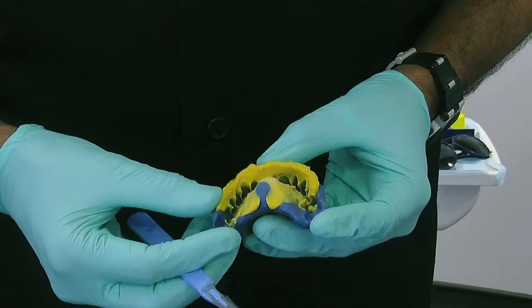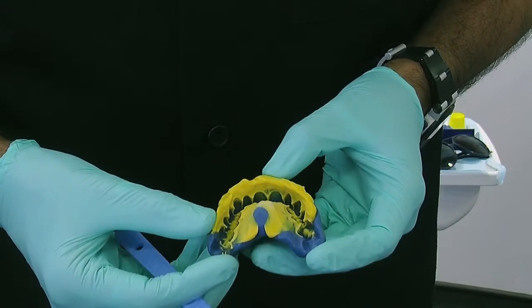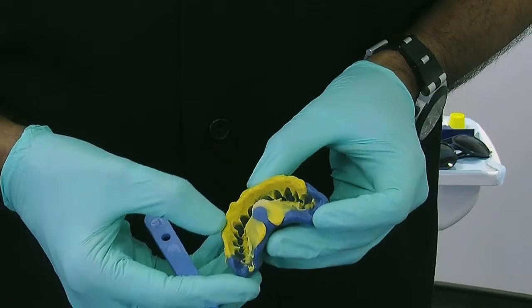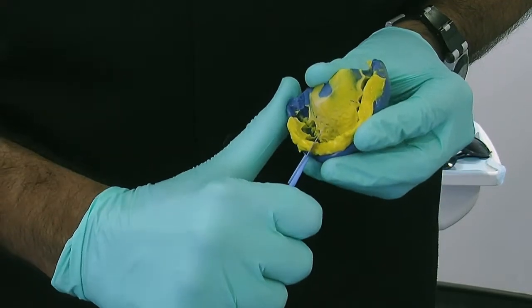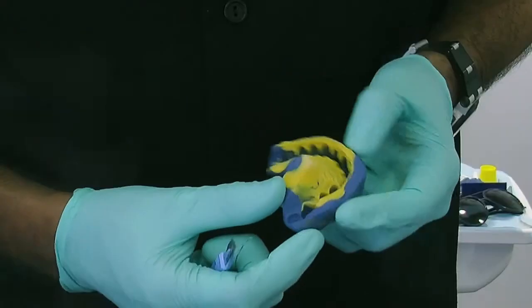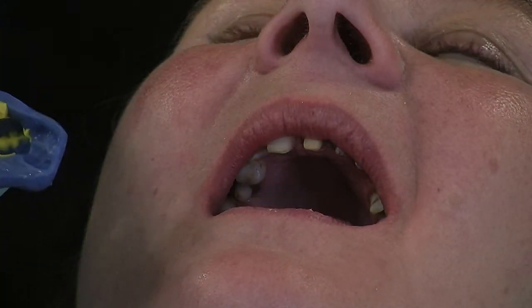We now have the putty and wash index of the wax ups that I took earlier on. What I'd like to do now is just trim up these excess parts and improve the shape of this. I'm just using a normal scalpel. Okay, it's all ready to use now. So I'd like to try the index in the mouth now.